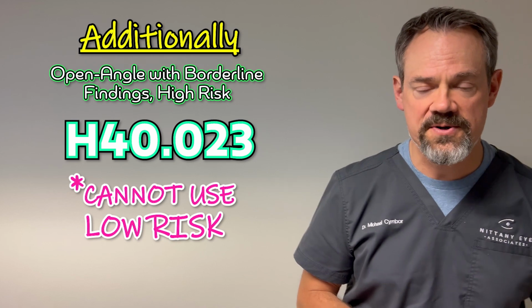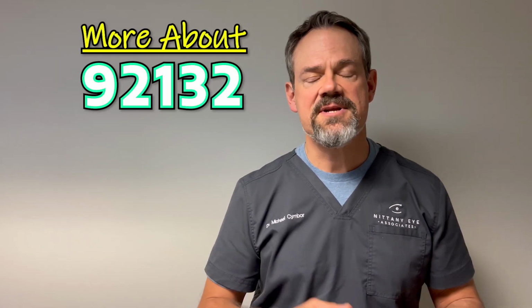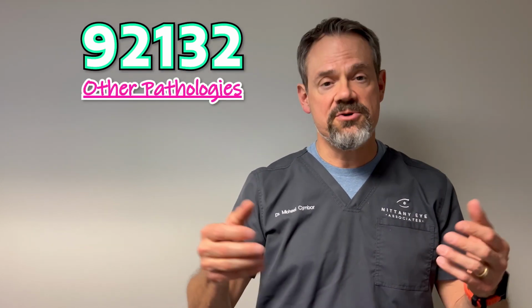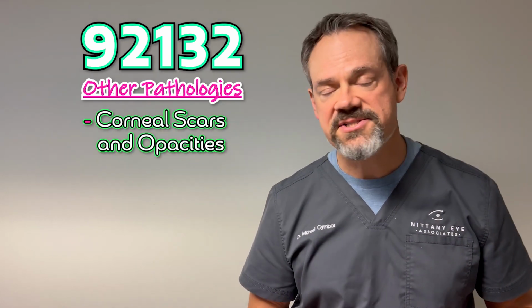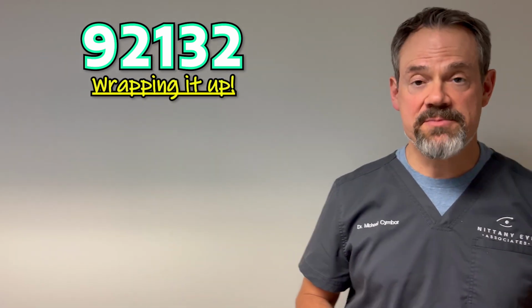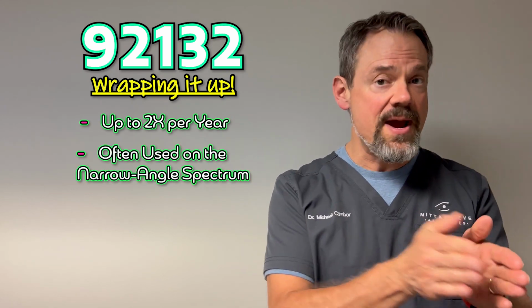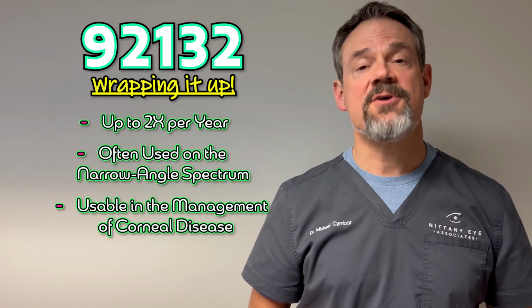In addition to all the glaucoma codes that I've mentioned up until this point, there are a couple other pathologies that would warrant doing the 92132, and that would be corneal scars and opacities, corneal edema, or even after corneal transplant. In summary, 92132 can be billed up to twice a year. It will most often be used on the narrow angle spectrum, but also can be used in the management of corneal disease.